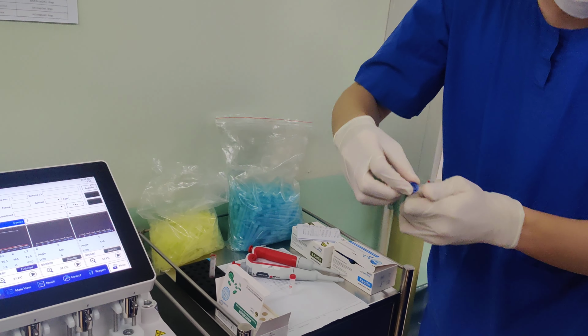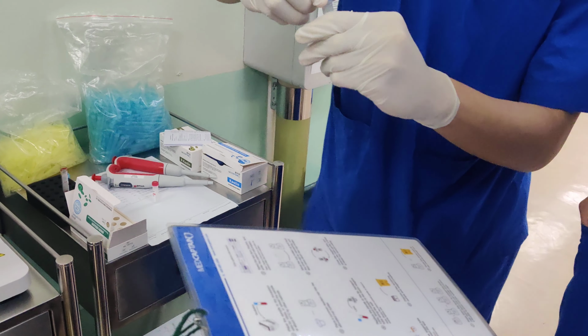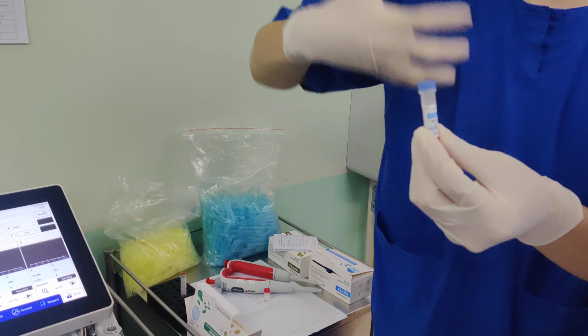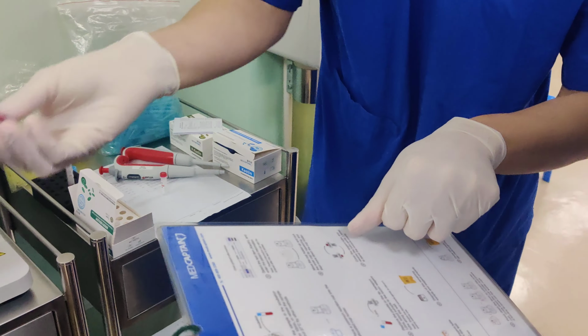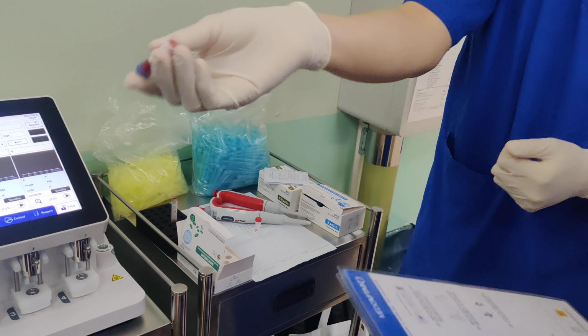Okay, so now we are at this step. We already put 1 ml. So by the way, why do we need to add it inside? This bottle has some components called kaolin, which actually facilitates the coagulation cascade. Okay, so now it's combined with fluid. We just mix it up. Gently blend the mixture evenly, more or less about 5 times.